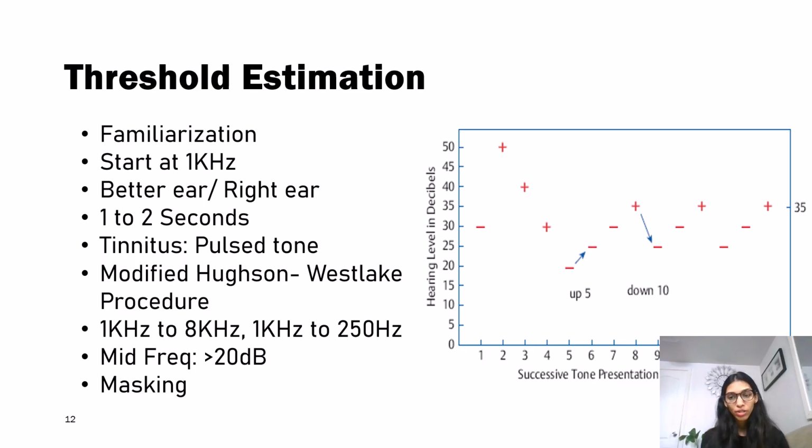The tone is presented for 1 to 2 seconds. If the patient has tinnitus, instead of giving a pure tone, you can use a pulse tone. We mostly use the modified Hughson-Westlake procedure. For that procedure, you can look at the graph.